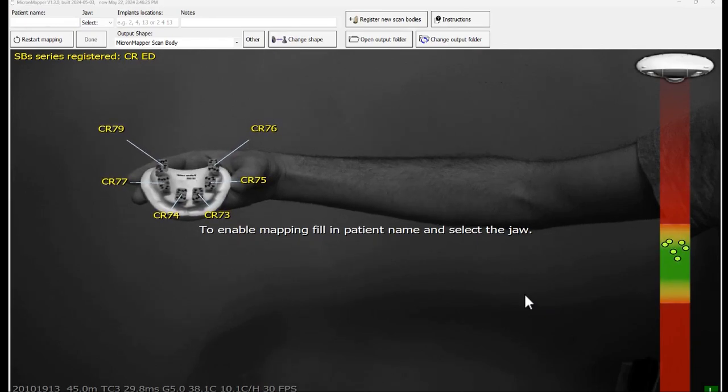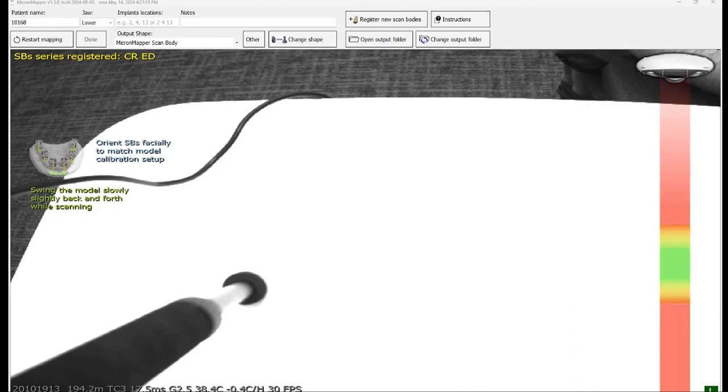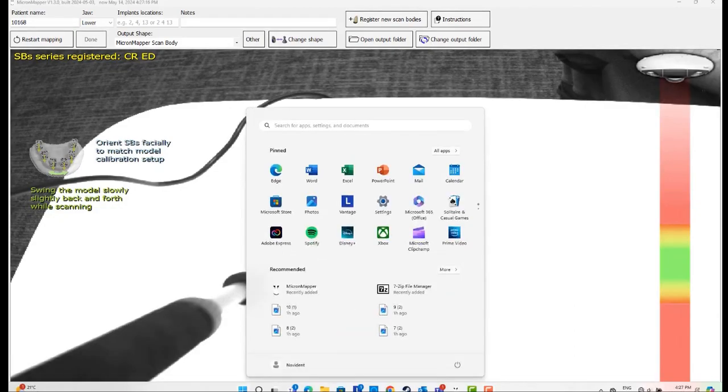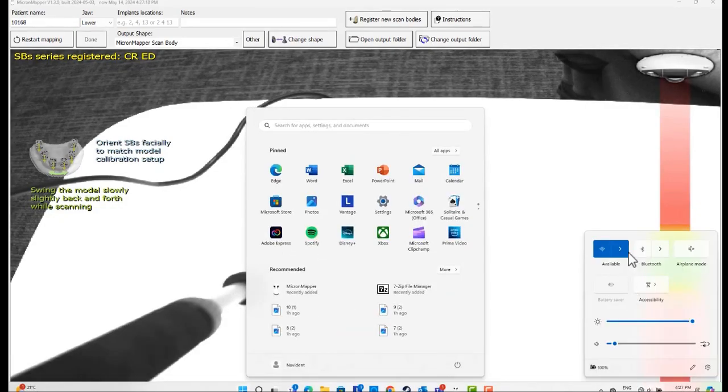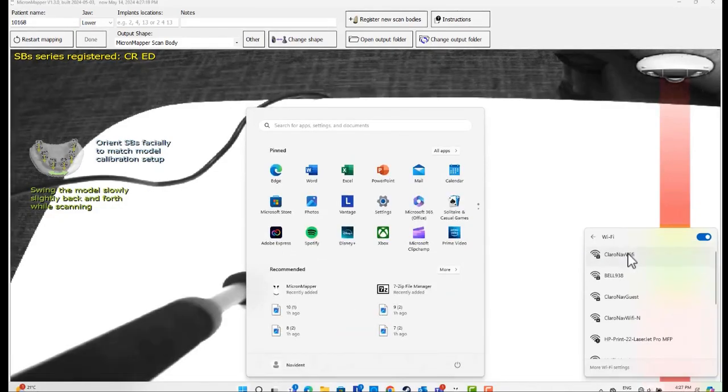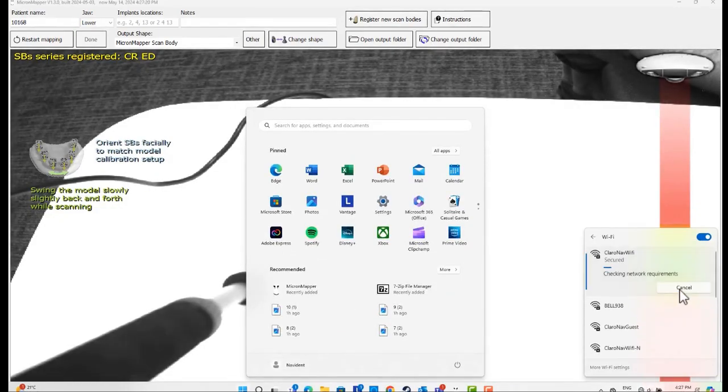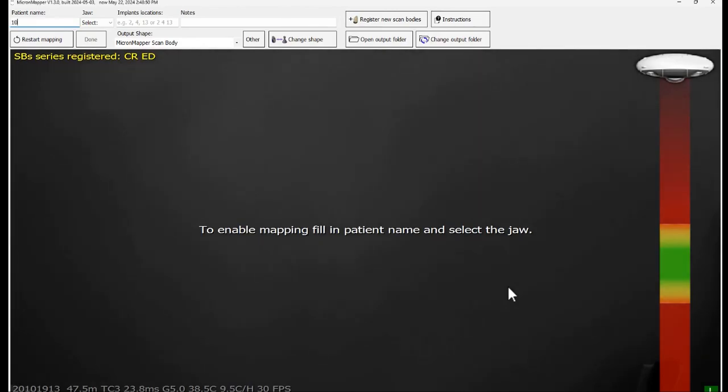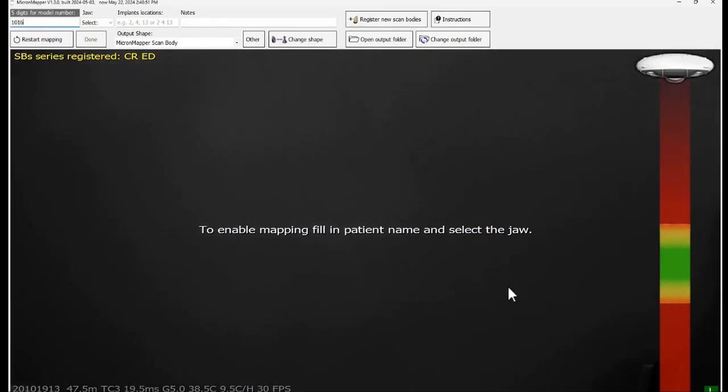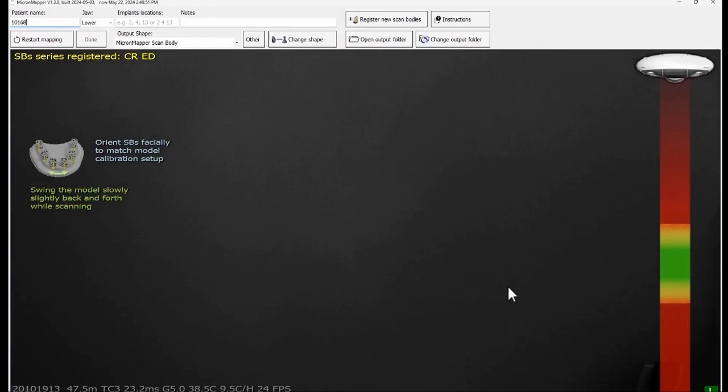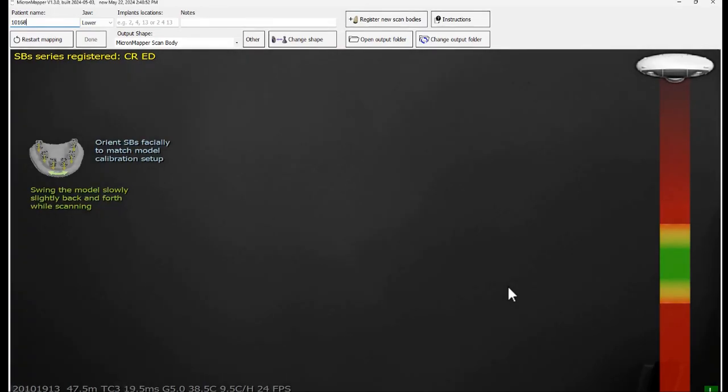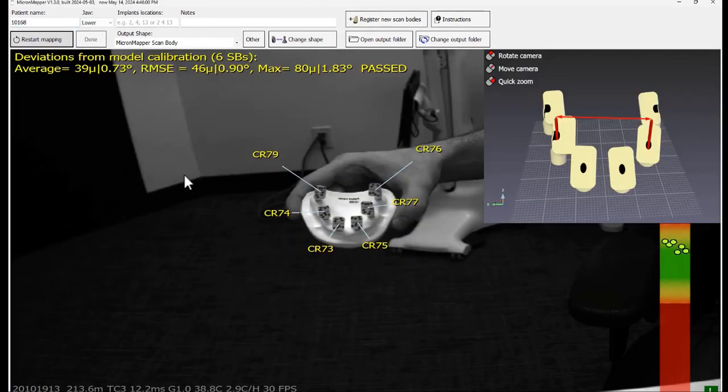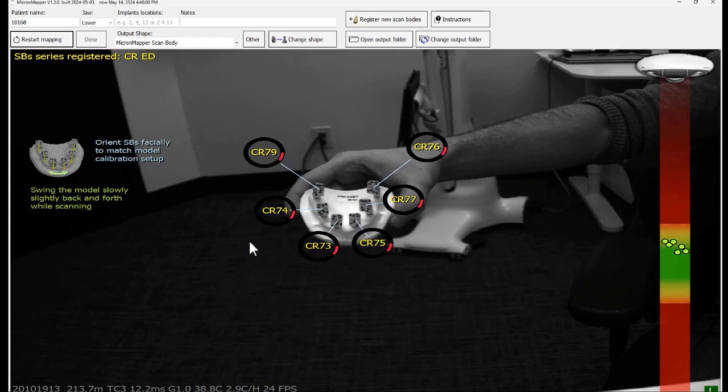To start with the accuracy check, you need to connect to the internet. Under patient name, insert the so-called patient name which is mentioned on the stone model. It should be a five-digit number and the jaw should be automatically selected for this. Keep the scan bodies in the view of the camera and observe that the process has started.